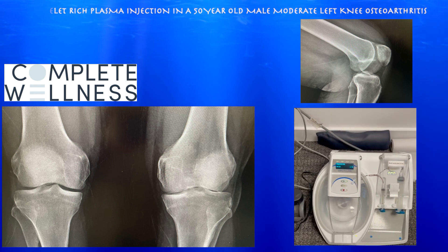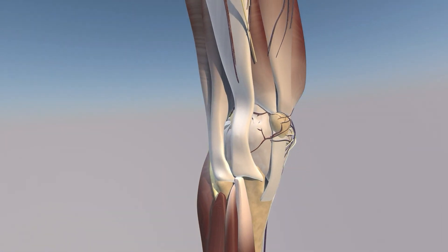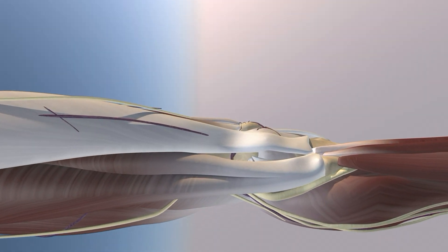We're going to use ultrasound to guide the injection. Here we're looking at some of the anatomy of the knee relevant to doing a knee joint injection. You can see the anterior lateral aspect of the knee, with the iliotibial band as one of the main landmarks we're going to use.